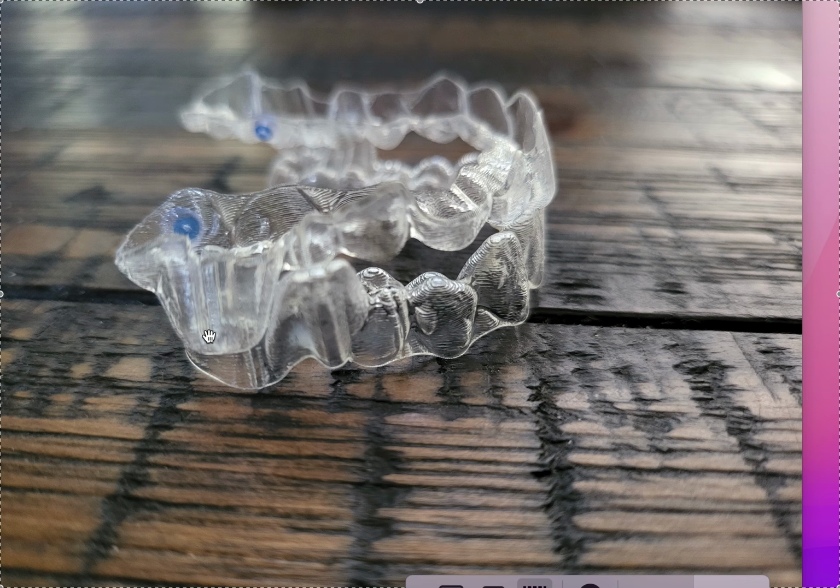That's standard of care. Does everyone do it? No. Should you do it? Yes, if you are growing a jaw, because that's baseline. If something went wrong, they'd be asking to see if you took the Ceph. Plus you need to know for sure. But I've got an entire playlist on Cephs, how to get Cephs if you don't have a Ceph, how to interpret a Ceph, blah, blah, blah. Okay, you don't have to know how to do that. You can send out for most of that. You can outsource all that. It's not a big deal.